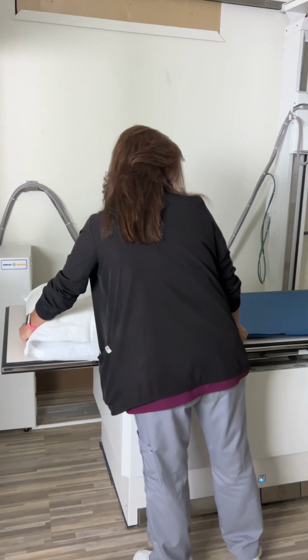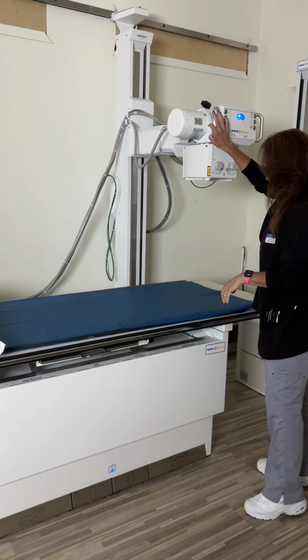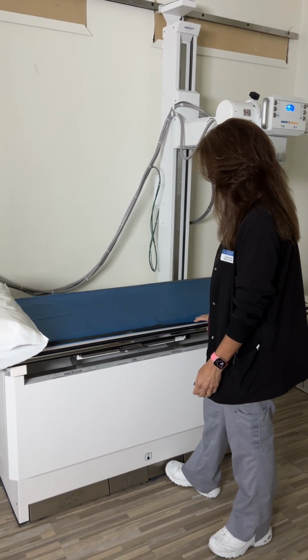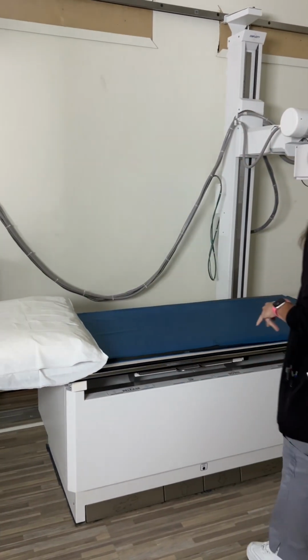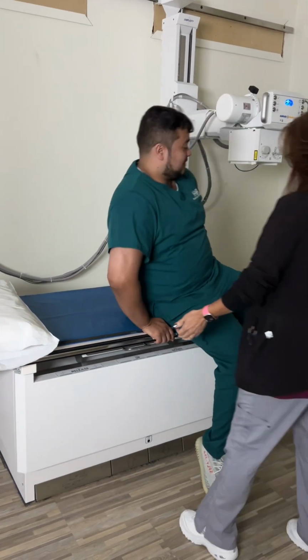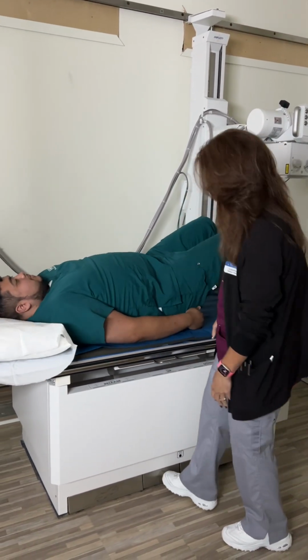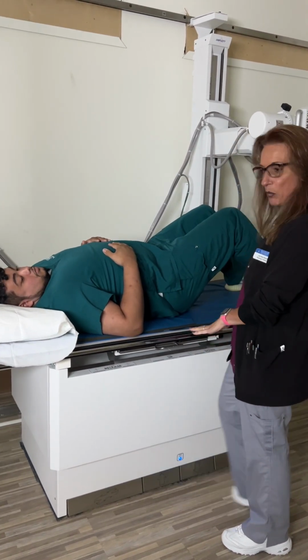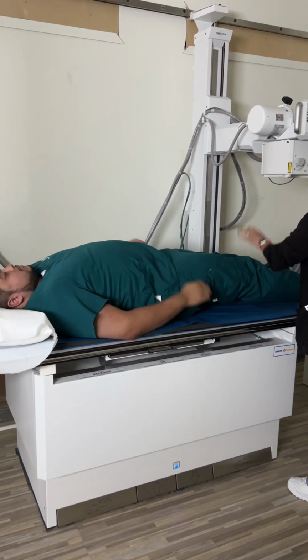Pillow up there, and the mat. All right. It's pretty tall, but we can lower the table if we need to get on more comfortably. All right, come on in here for me. And we'll let you have a seat on here and lie on your back. All right, and then we'll raise this up. And that table will stop at 40. I could go beyond that. Can you straighten your legs out? But it is kind of nice that it stops at 40.